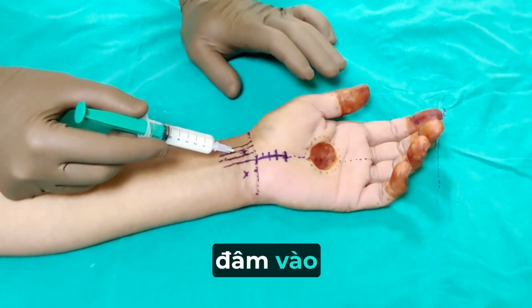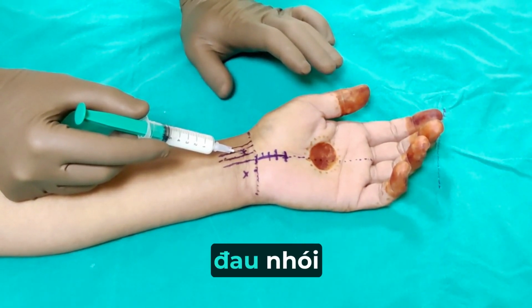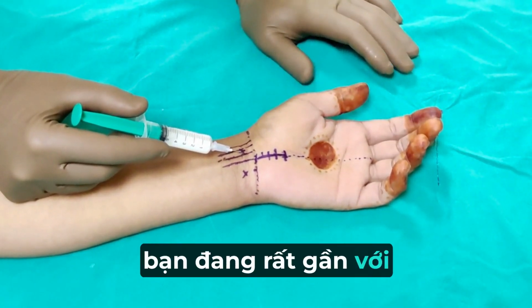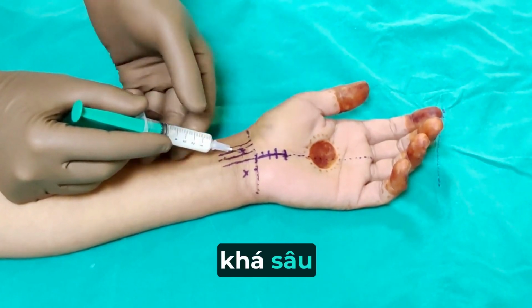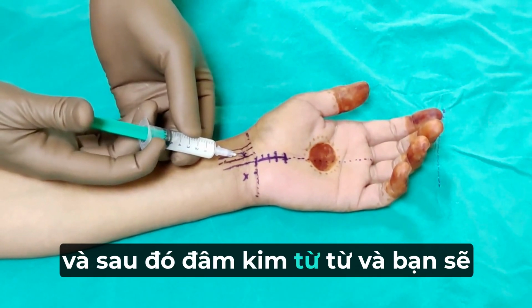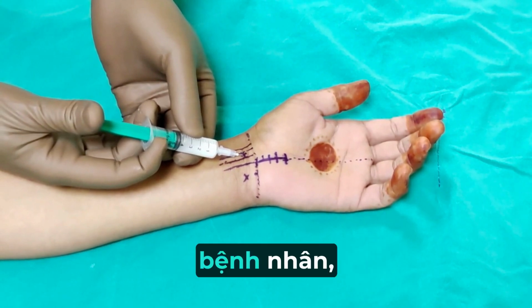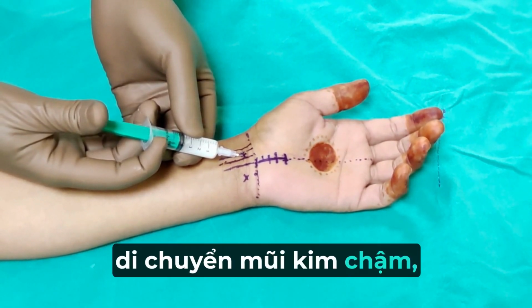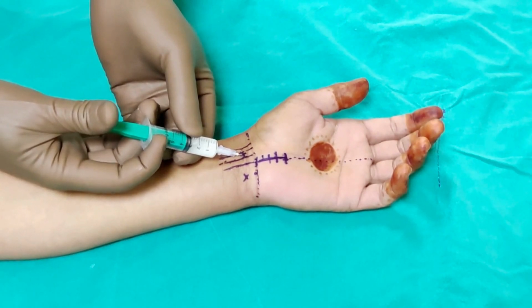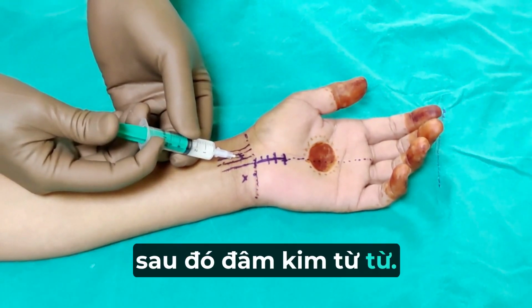If at any point you are close to the median nerve, the patient will complain of a sharp shooting pain, and occasionally you may see twitching of the fingers. That means you are very close to the nerve. Now I am quite radial to it, so I'm just going to inject slowly, just aspirate and then just go slowly, and you will not find much resistance. It is slightly discomforting for the patient, but if you go slowly, it's usually not that painful. It's always a good idea to aspirate and then go slowly.